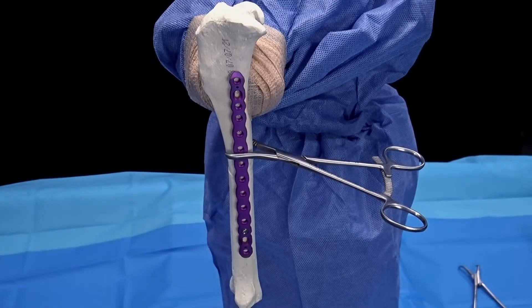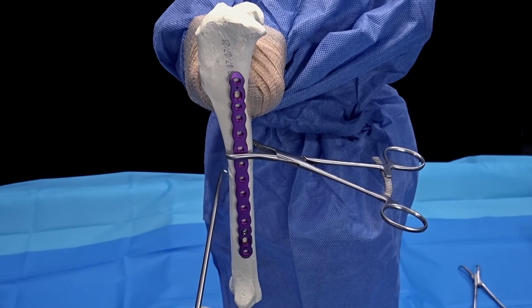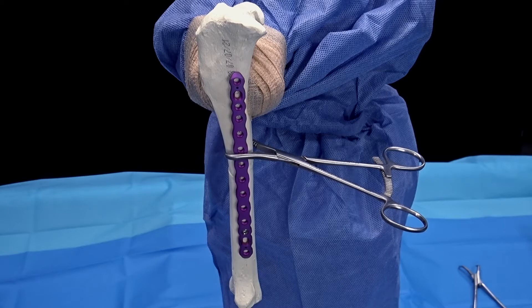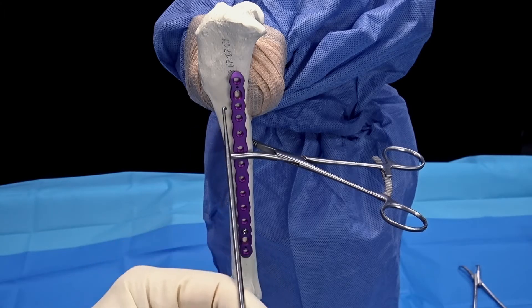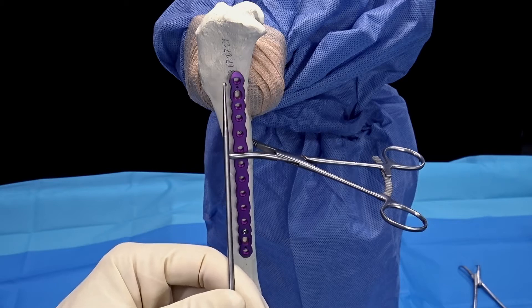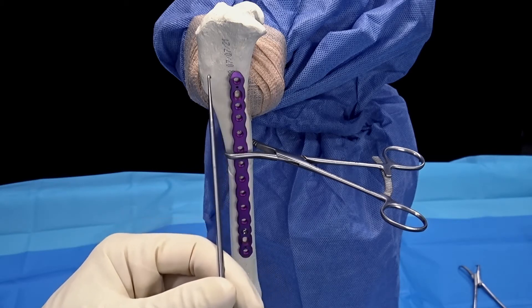We're going to demonstrate repair of a sawbone model consisting of a short oblique fracture in the mid-tibial diaphysis using the Arthrex OrthoLine. This is a 3.0 millimeter titanium plate. The fracture has been reduced and the plate has been secured to the bone with a lobster clamp. We're going to first place a BB-TAC in the slide hole, which is on the short end of the beveled plate.